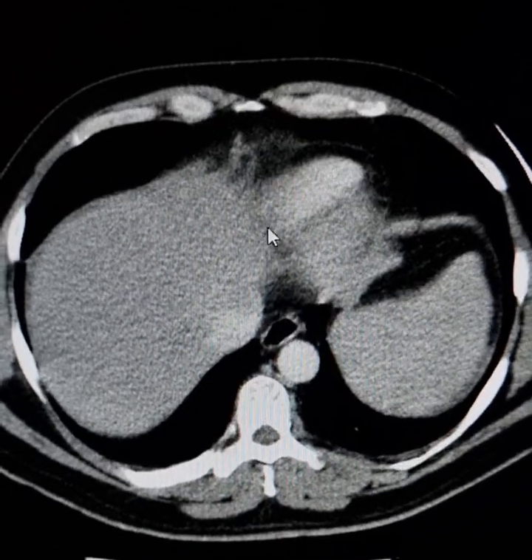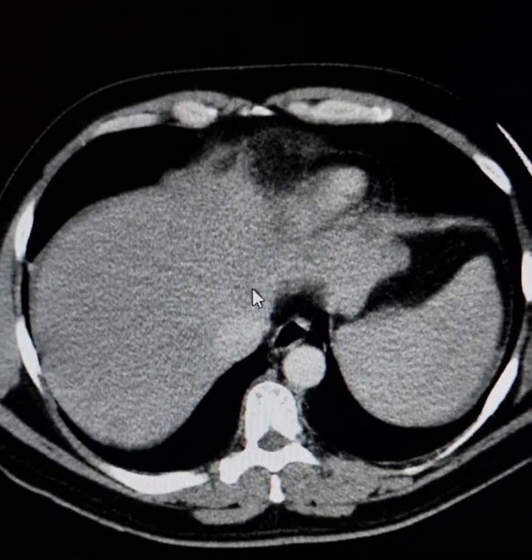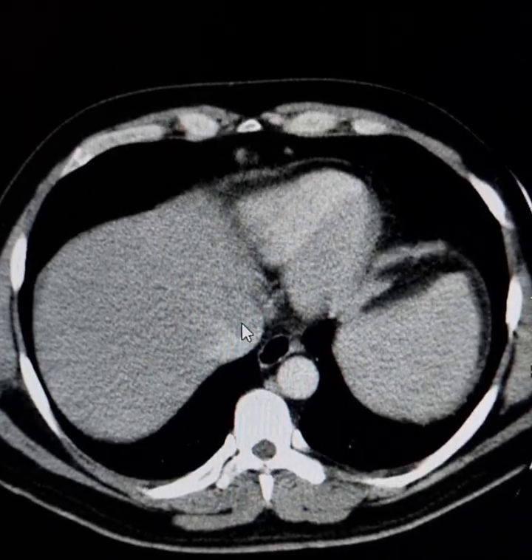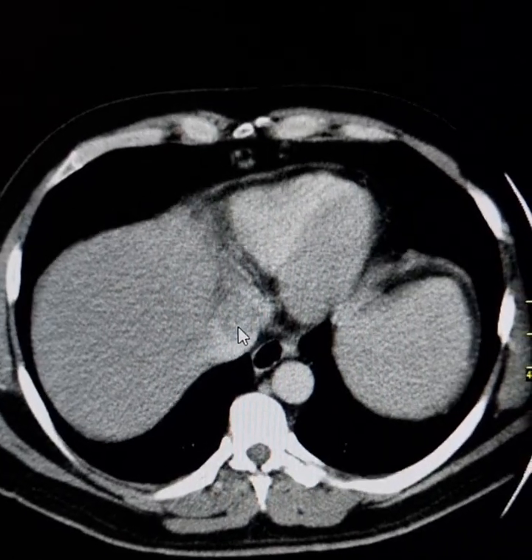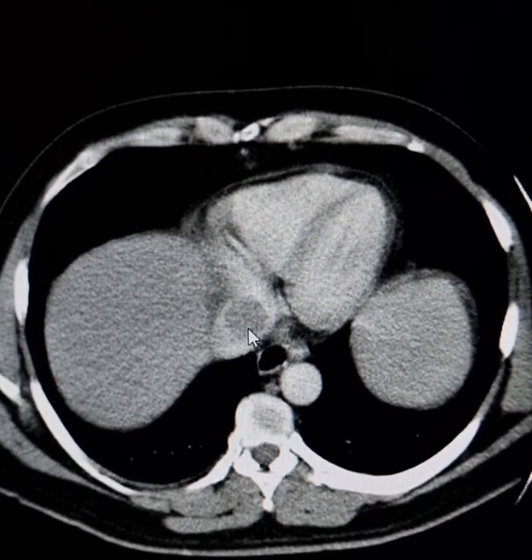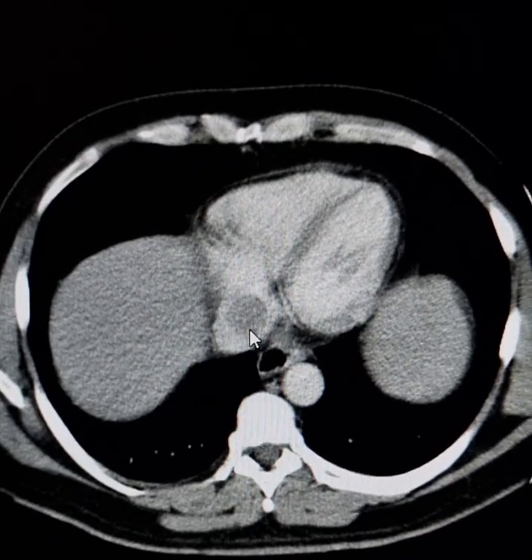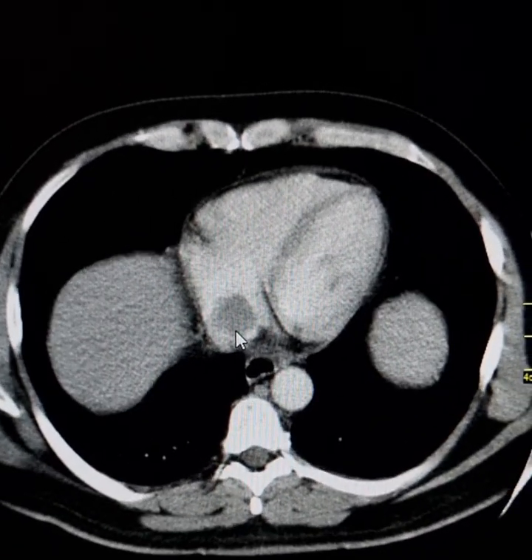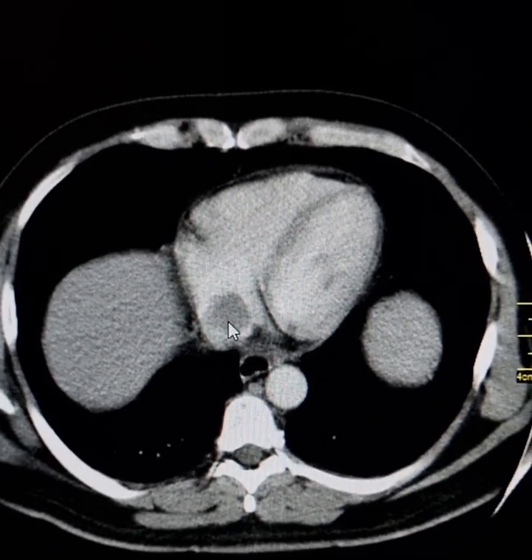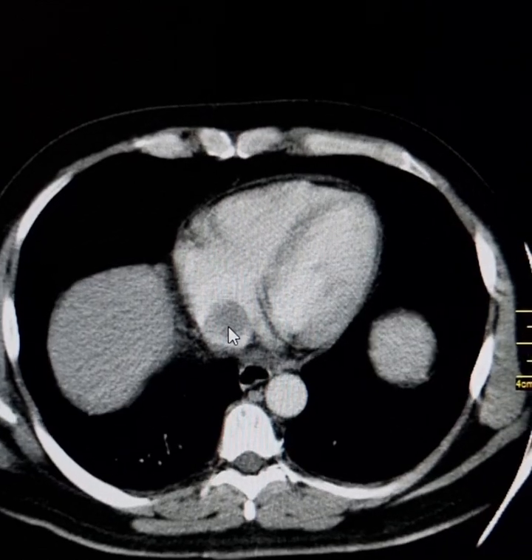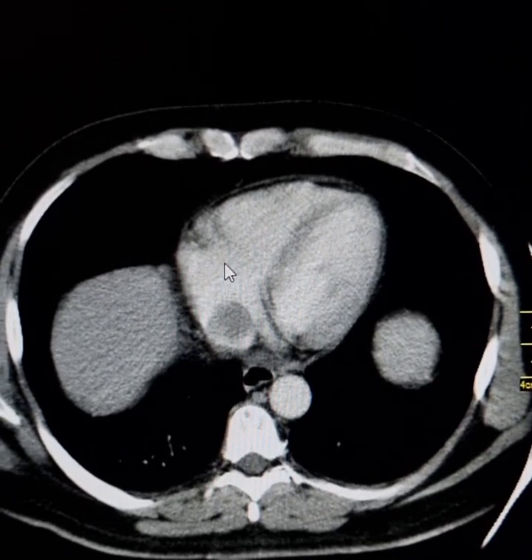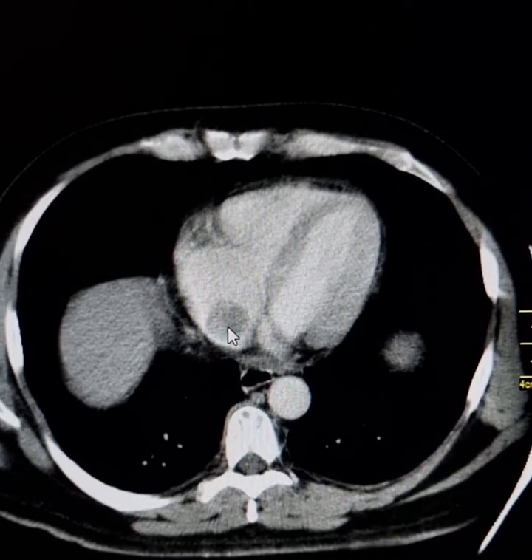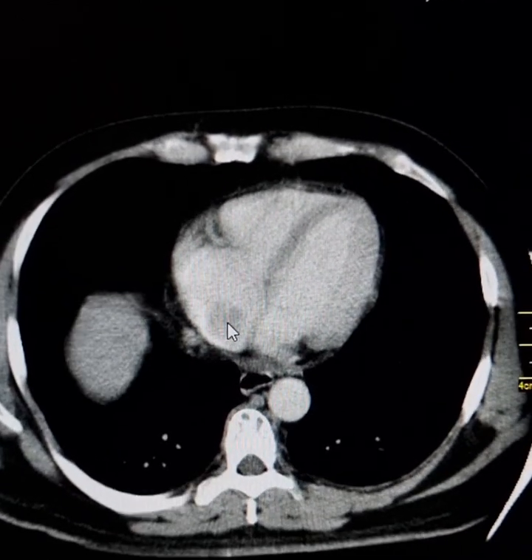Tumor thrombus has grown into the left hepatic vein and into the inferior vena cava. Tracing upward, the tumor thrombus has grown into the right atrium.